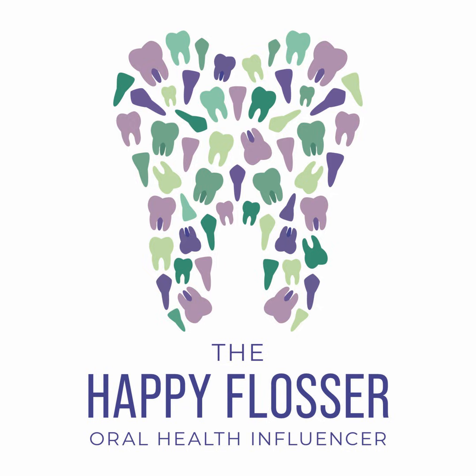So I'll look all across the dentition at the crestal bone height and the contour. I go right to the trouble spots too. I want to look between the maxillary first premolar and the canine, and I want to look between the mandibular second premolar and the first molar. Those tend to be dead giveaways for us to see if there's early signs of disease, if that patient has had a history of periodontal issues before, and if there's any change in that crestal bone height or contour.